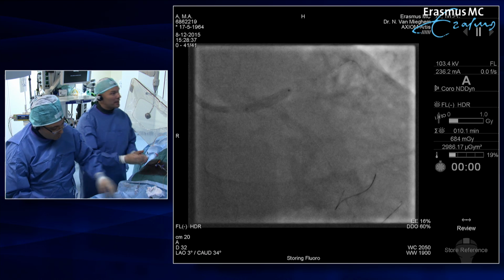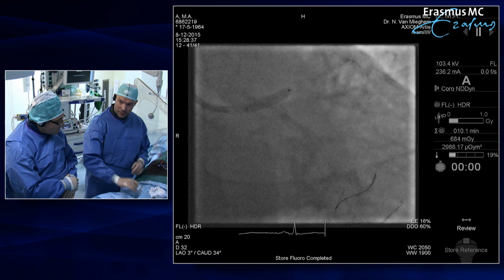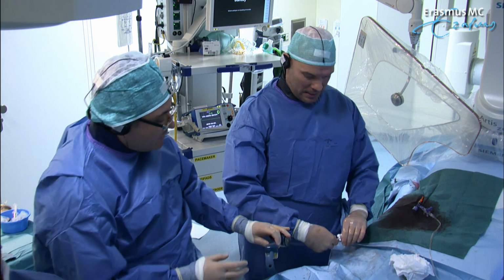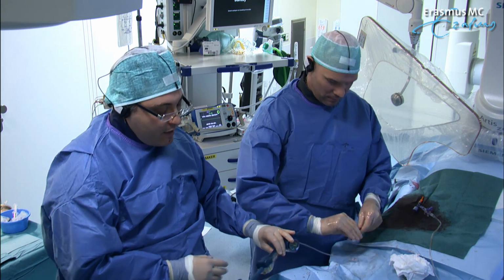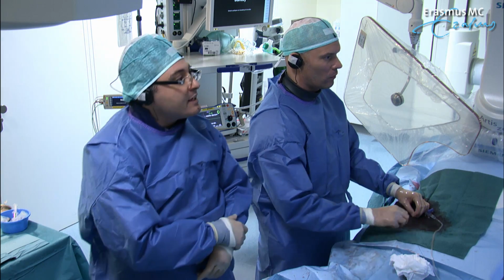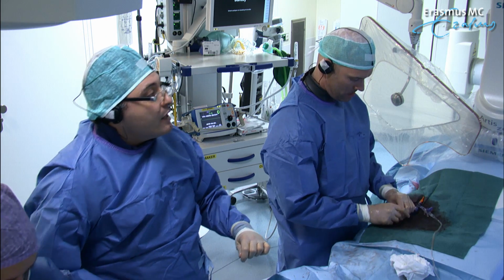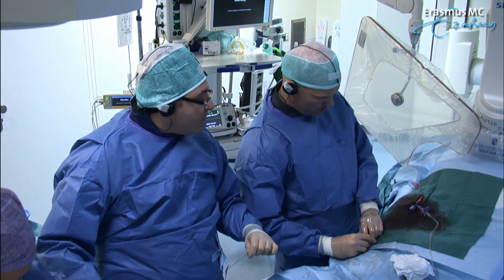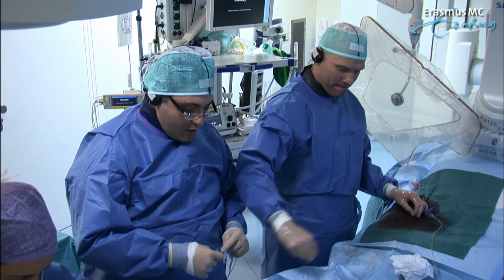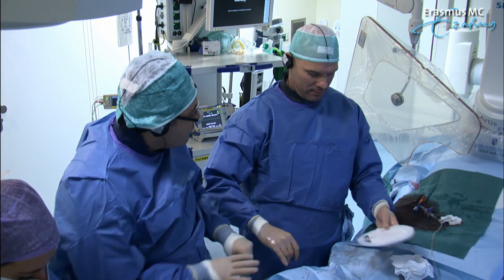And now we need to post-dilate the proximal edge of the stent with a 4.5 non-compliant balloon. So, 4.5 by 8. I go back to the discussion that we were having. If we consider that we are less able to correctly assess the significance of a lesion in an ostial side branch compared with a main vessel, then a study comparing FFR-guided PCI of bifurcation versus angiographic-guided PCI of bifurcation would be very interesting.